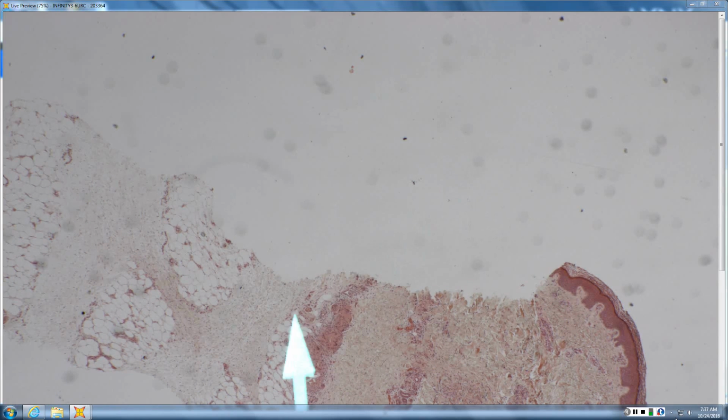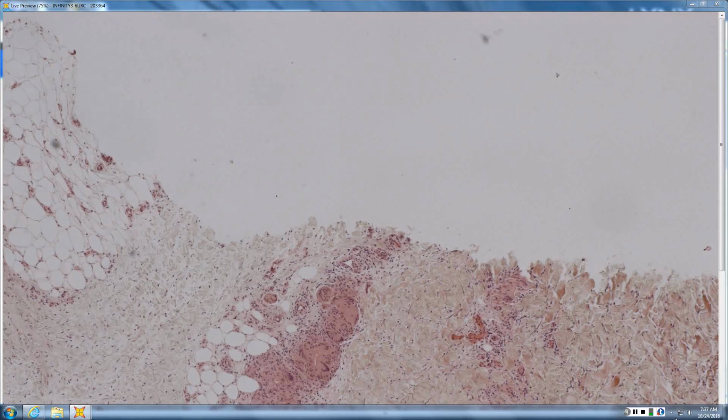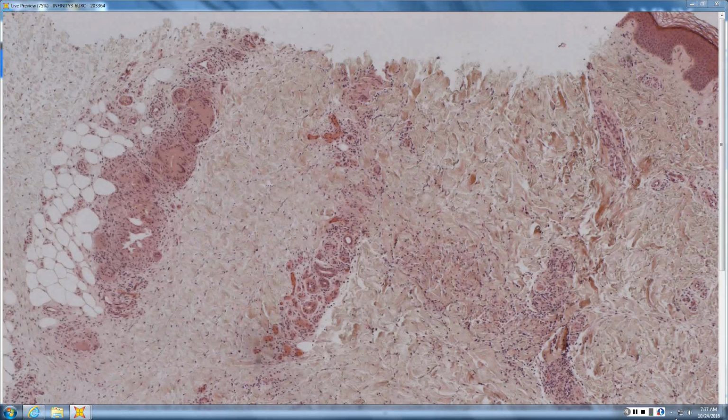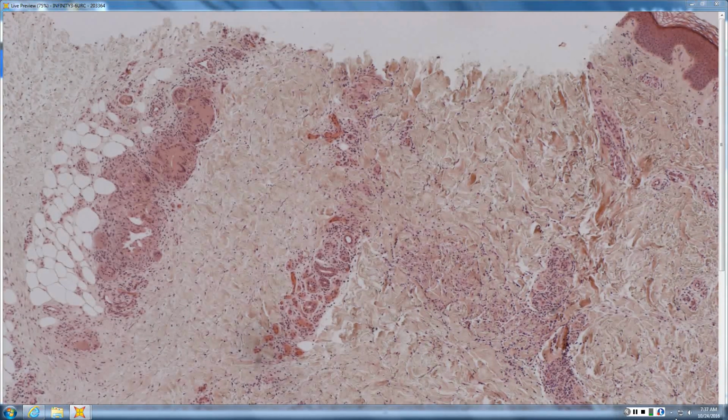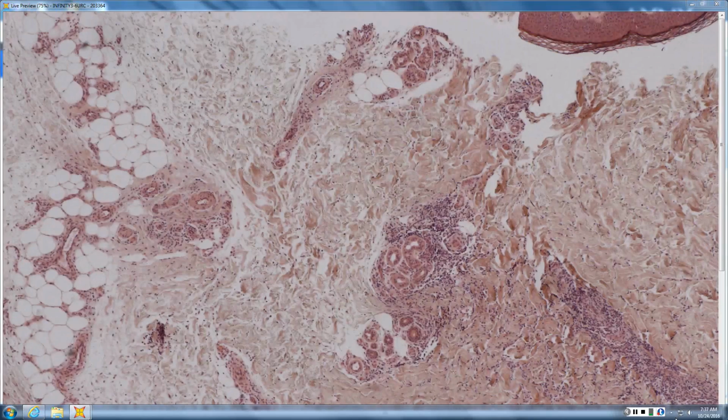The one I was kind of going for with granulomas parallel to the surface was leprosy, but that rarely gives giant cells. It's histiocyte granulomas, typically in the absence of multinucleated giant cells. Here you have very prominent multinucleated giant cells. You also have a different pattern of granuloma here. So what would this pattern be? Where it's all in between the collagen levels. Interstitial. So you got interstitial, and you have horizontal.